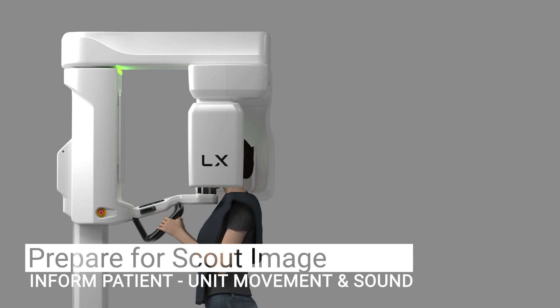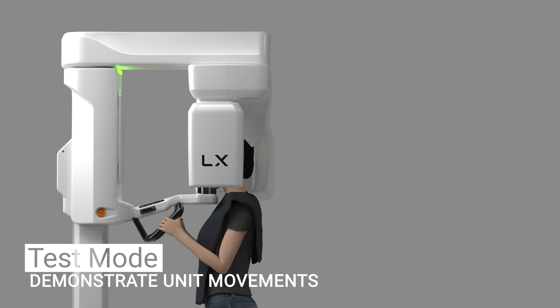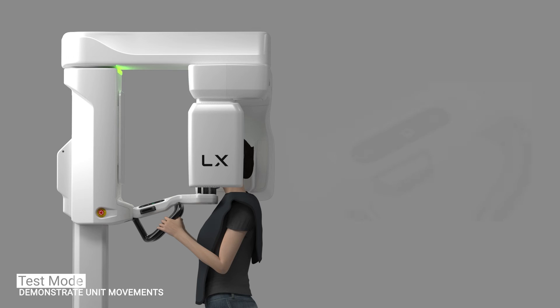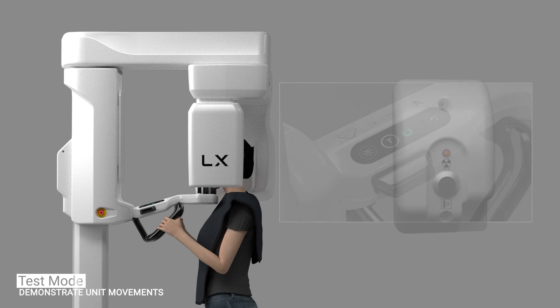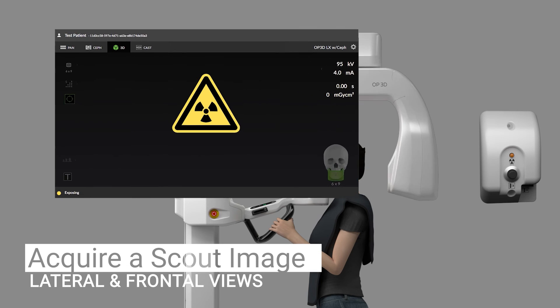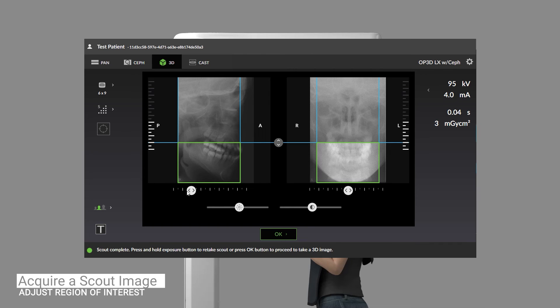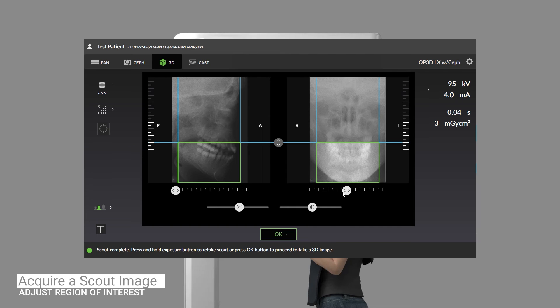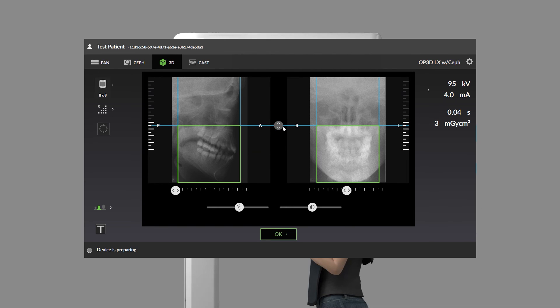You're now ready to acquire a scout image. Before acquiring a scout image, inform the patient that the unit will rotate and that an audible sound will occur. If the patient is feeling insecure or has exceptional anatomy, use test mode to demonstrate the unit movements and to ensure the rotating unit does not collide with the patient. Activate test mode from the GUI or by pressing the test mode button on the control panel, then press and hold the exposure button — the unit will rotate without generating x-rays. When ready, press and hold the exposure button to acquire a scout image. A lateral and frontal scout preview image appears on the screen. If the region of interest is not centered, without moving the patient, click the sliders below each image to adjust the position of the 3D scan. You can also increase or decrease the height of the scan by sliding the height adjustment icon up or down. It is recommended to take advantage of beam collimation to limit radiation exposure and help ensure an optimal field of view. You can retake the scout image if needed or proceed directly to image capture by pressing the OK button.